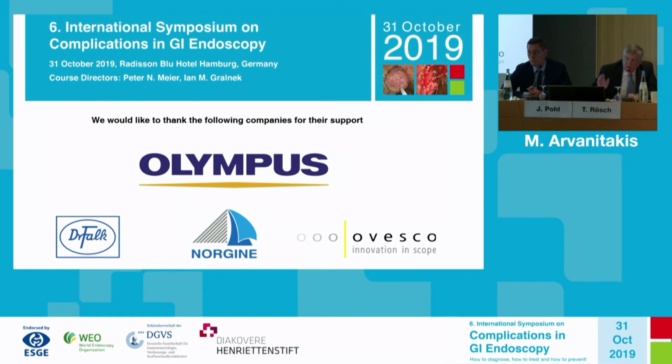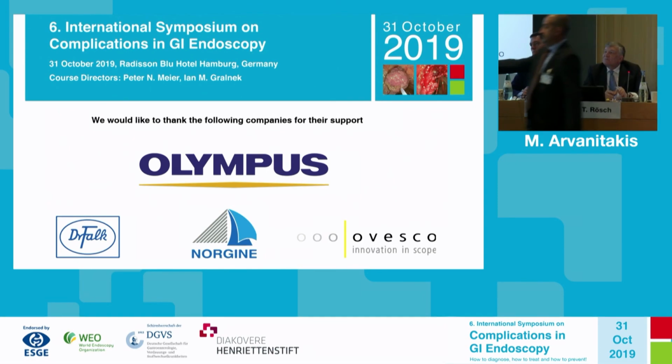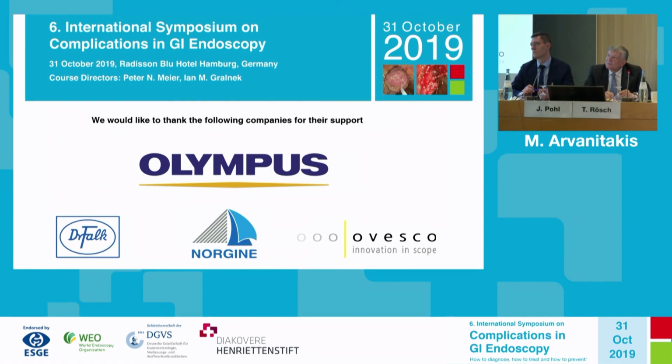Yeah. Well, finally, maybe we ask a question to the surgeons. Should submucosal tumors be done endoscopically? I mean, there's a substantial risk of deep margins not being free. Well, thank you for the question, but this depends very individually on the case. This is very difficult to decide in total. There are some limits, of course, and especially if there is suspicion of malignancy and aggressive tumor, then surgery would be, of course, more appropriate.